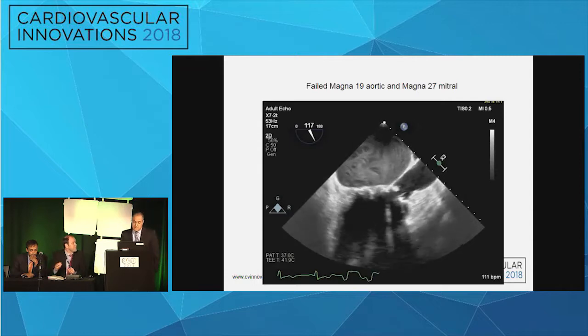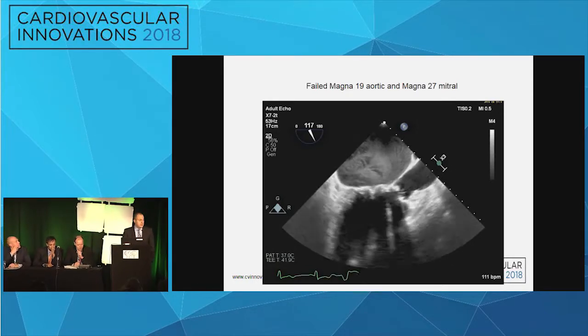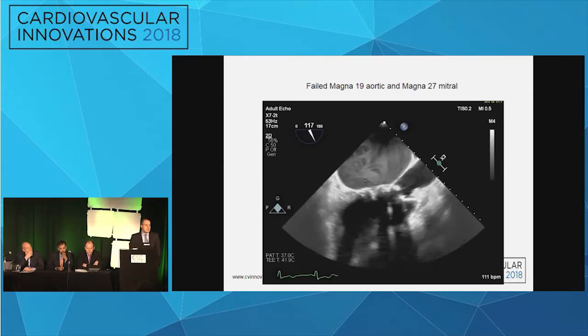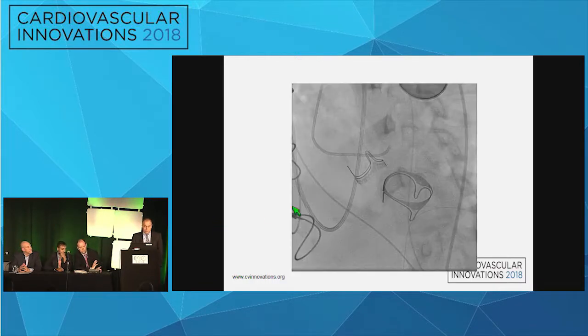It's true. It seems that working on the aortic position, at least to me, with all that stagnation of blood in the LA, she would just die. We'll start working on the aortic valve and she will just die in the room. And also, it's clear after understanding that she is high risk for left main obstruction, we can put stents and do what we did before, but the right way to do is to do BASILICA and to cut that left cusp leaflet. It doesn't make sense with all of the material that she has here to do the mitral implant first and then to do BASILICA with the snaring and all that in the LVOT. There will be too much material to work in.